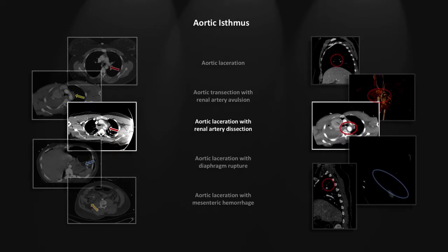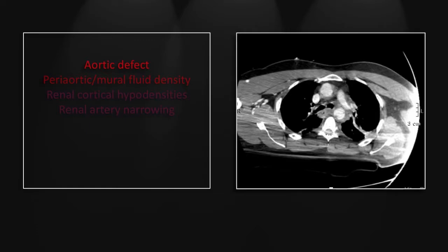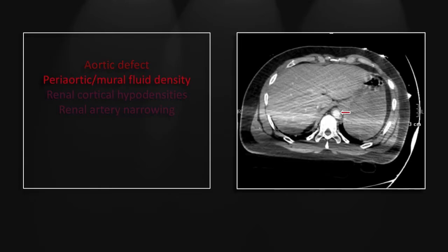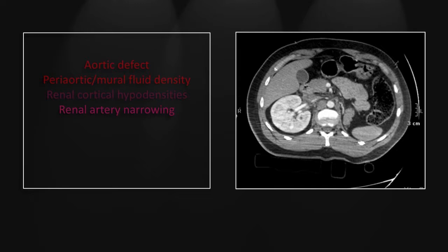Our next case is an aortic laceration with dissection of the renal artery. Here again, you see the proximal defect and the distal defect in the aorta. This is a high-grade laceration — I would call it almost a near transection, and we'll appreciate that on the sagittals. A helpful finding here is thickening of the aortic wall or the presence of periaortic fluid; in either case, it's a helpful indicator of the presence of a vascular injury. Here you see wedge-shaped peripheral cortical hypodensities consistent with thromboembolic phenomena, but they're regional — posterior and superior in this single right kidney. Here you see stranding in the right renal hilum and a small segment of irregular, indistinct right renal artery consistent with a dissection.